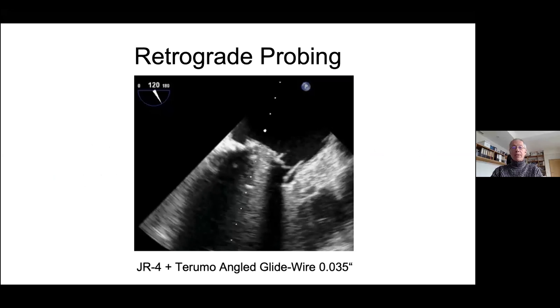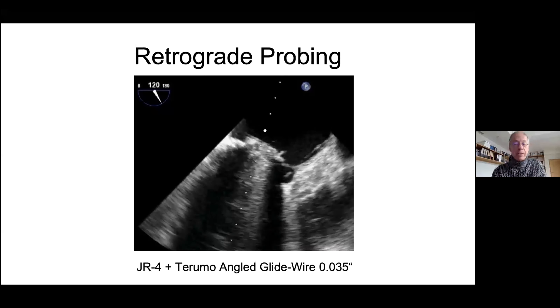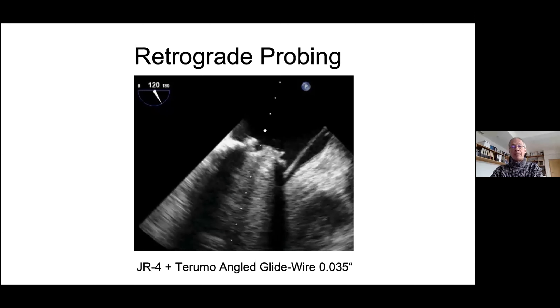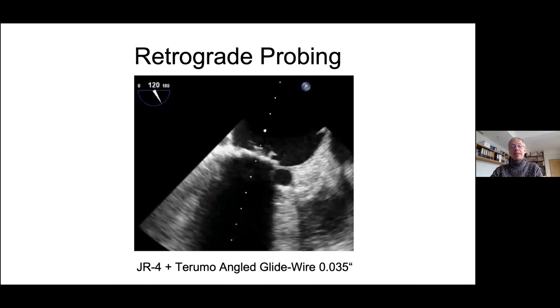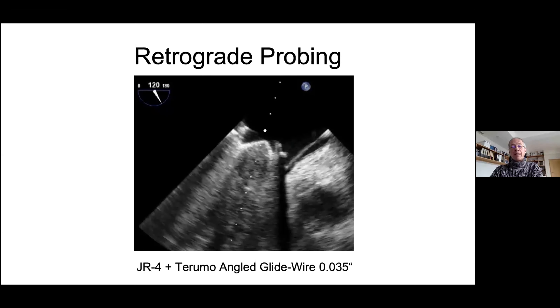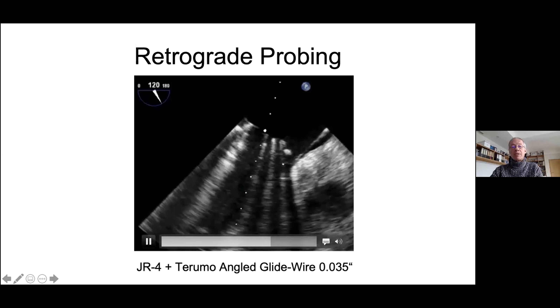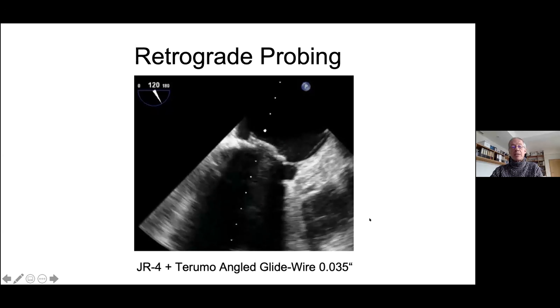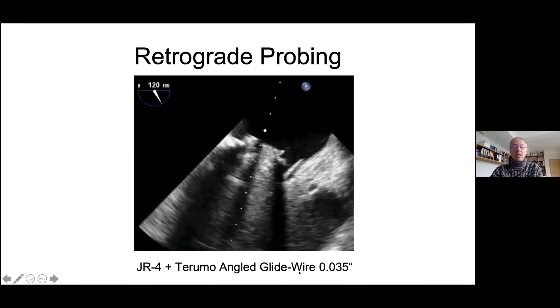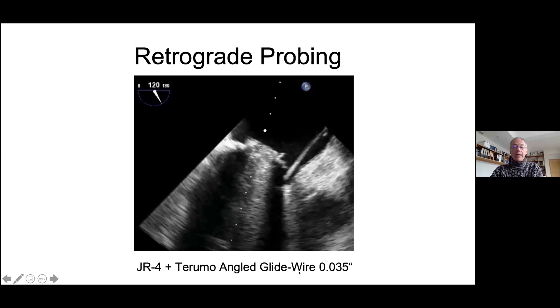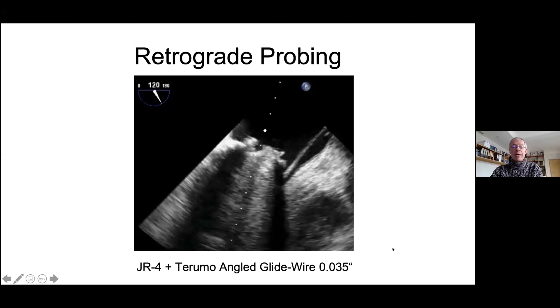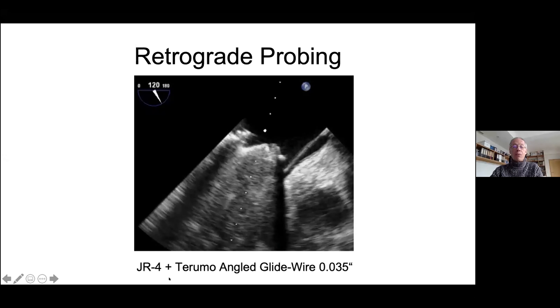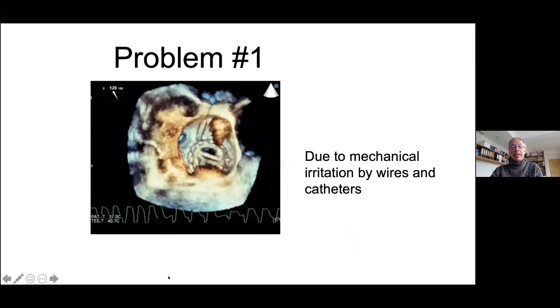With this technique, I do not really need transeptal punctures. You can see this is the valve, you see the left atrium, and the wire is across the leak. This was a Terumo angled wire, 0.035, and I used a JL4 to cross that leak.